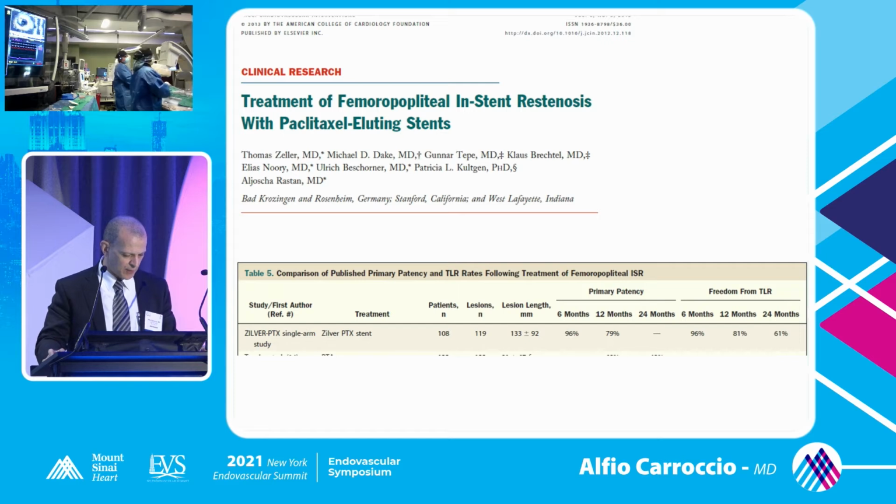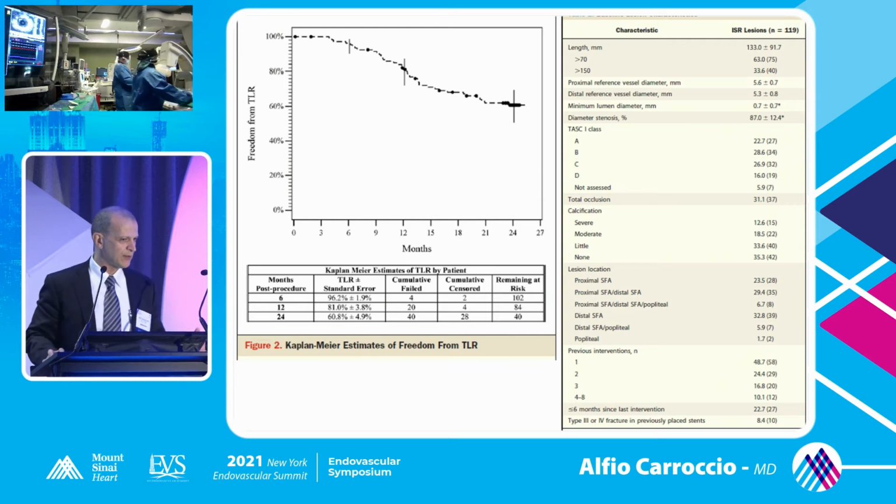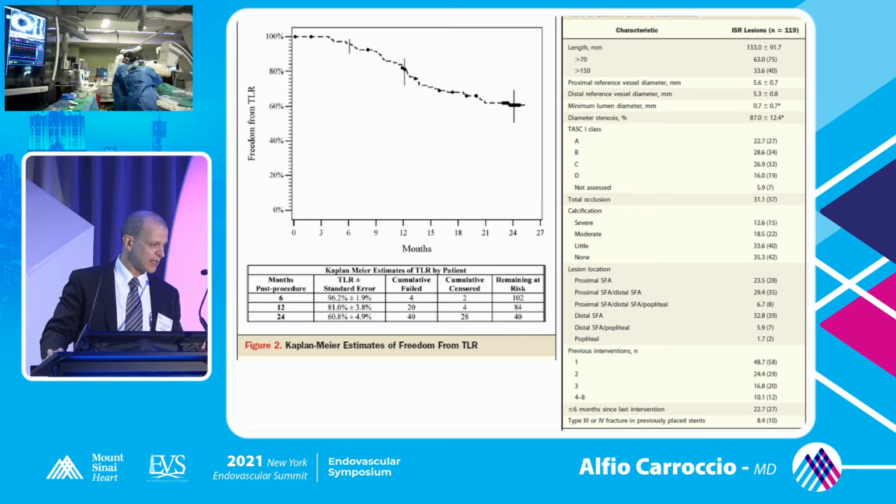Paclitaxel, a few years back, they had some of their results for freedom from TLR, at 12 months, 24 months, it was 81 and 61%. Well, what's the follow-up to that? They recently had some newer data that's come out, and it's important because it's hard to compare some of these trials because there's no back-to-back trial for DCB, covered stents, and standard stents. And that's one of the issues because there's so many variables, and when you deal with PAD, even limited to the SFA-pop, as you mentioned, occlusions, long segment lengths, duration, size of the vessels.